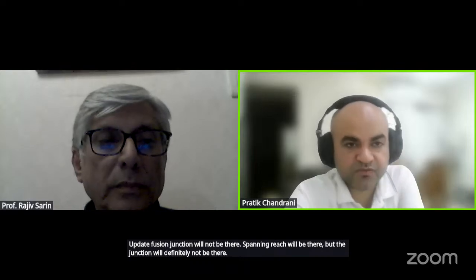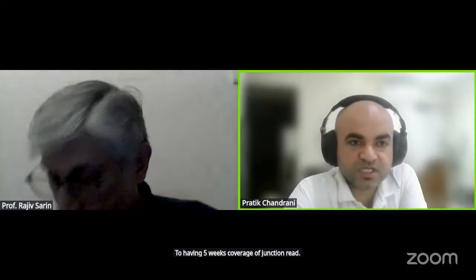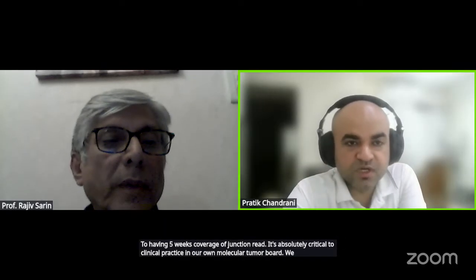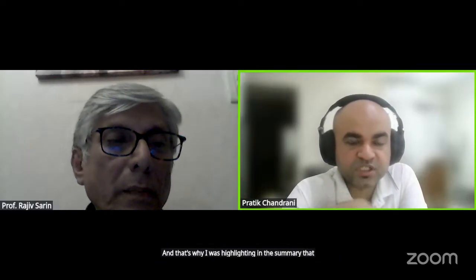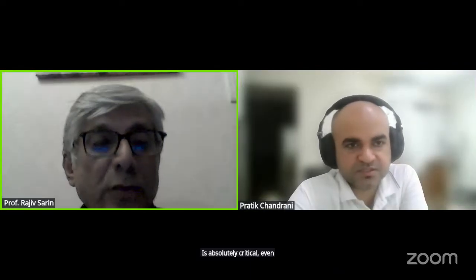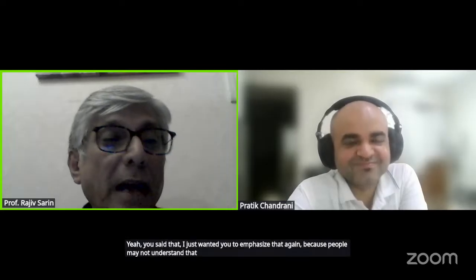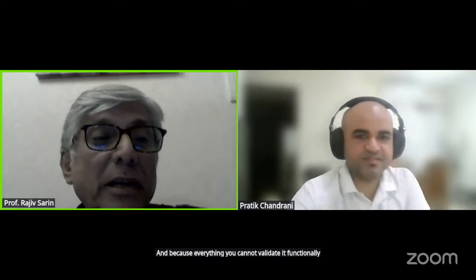So having 5x coverage of junction reads is absolutely critical for clinical practice. In our own molecular tumor board, we use that cutoff. That's why I was highlighting in the summary that having junction read count and spanning read count is absolutely critical. I just wanted you to emphasize that again because people may not understand that, and because everything you cannot validate functionally or by another method, you have to just go by what you get.